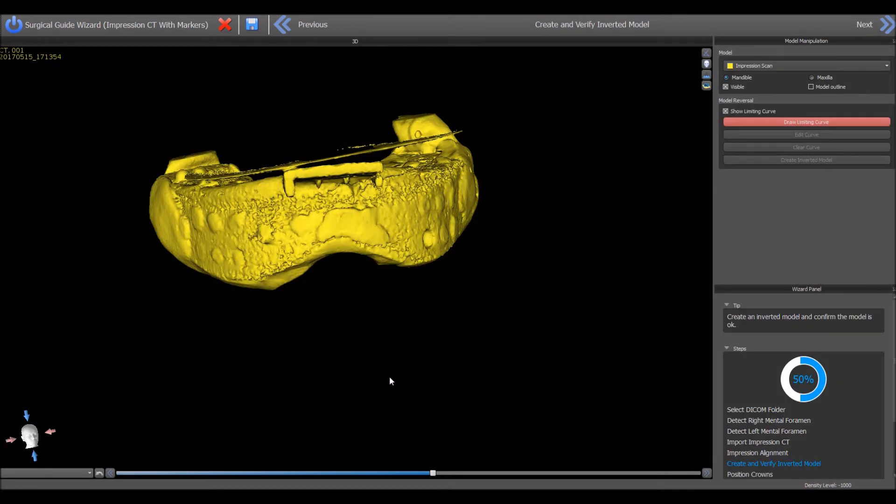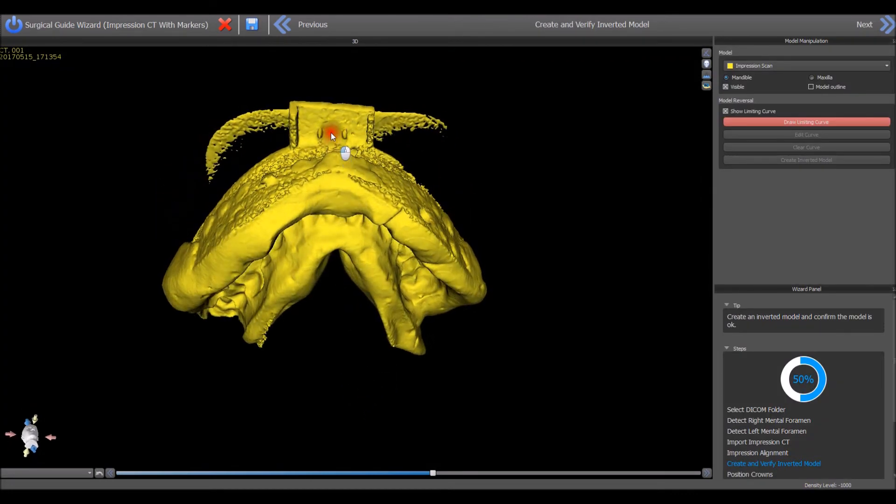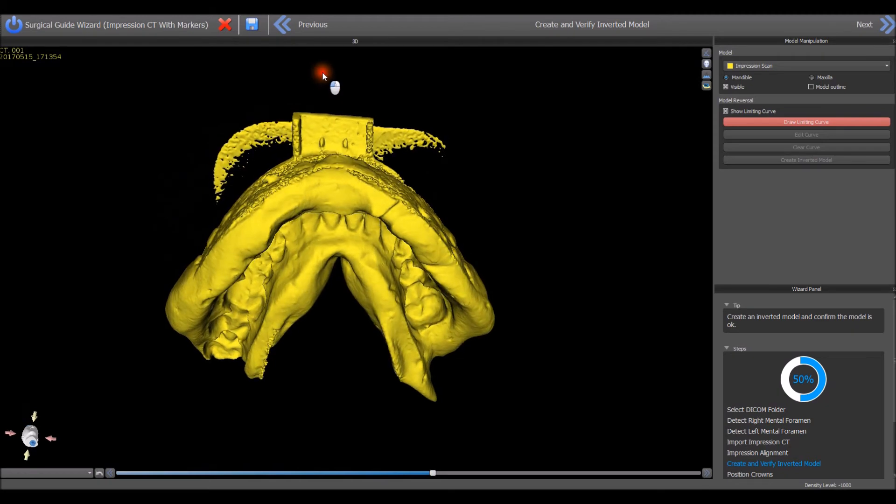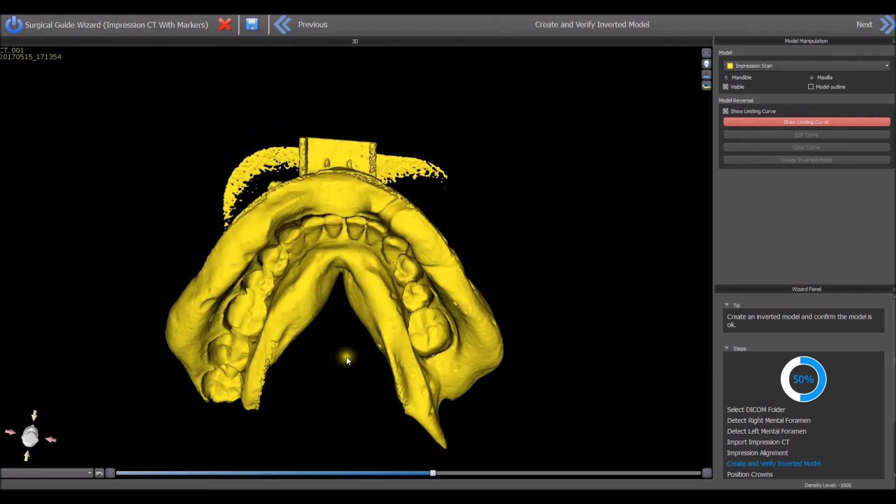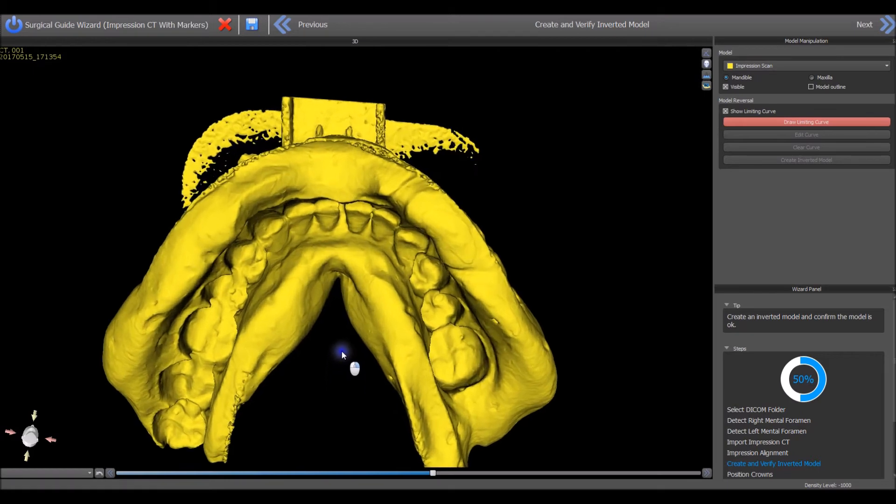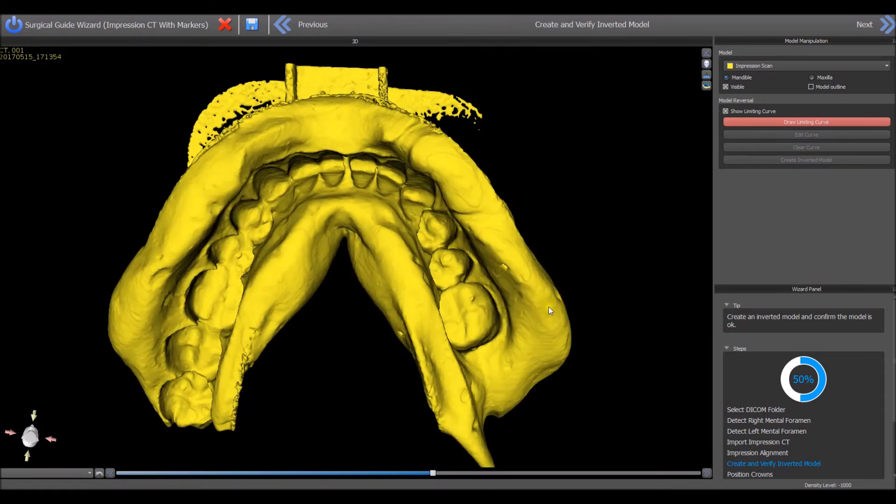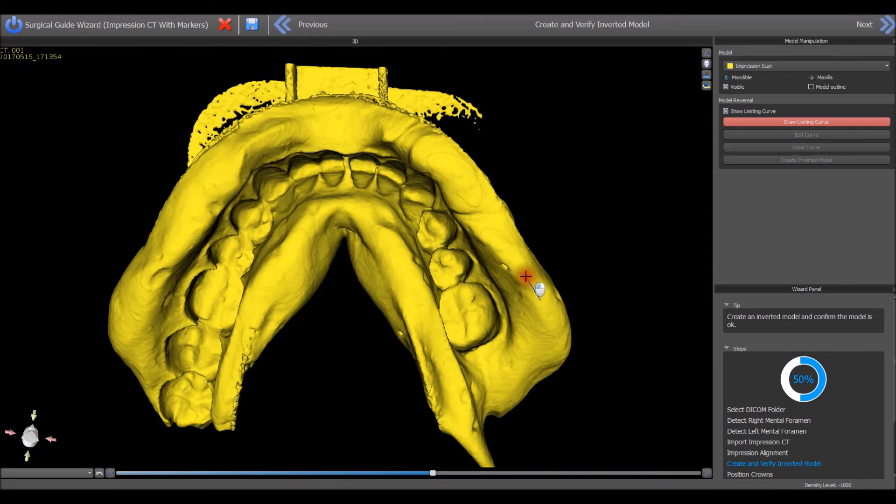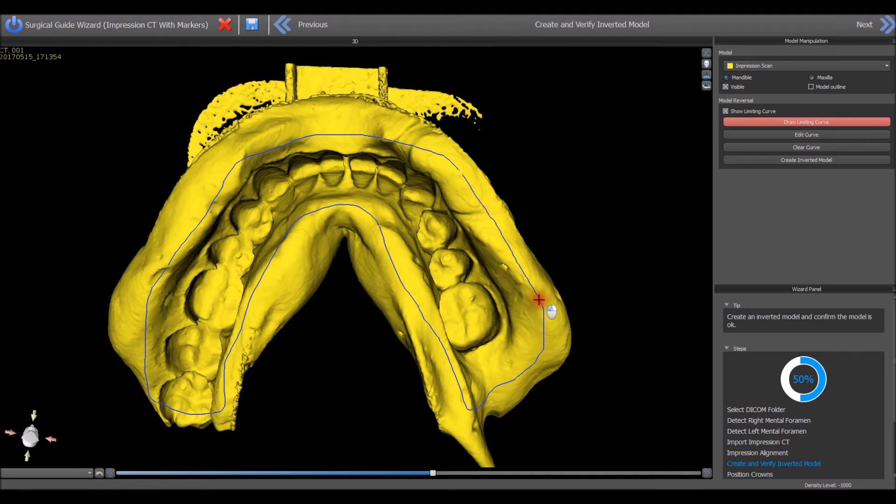Hold the left mouse button to grab and rotate the Impression Scan. Hold the right mouse button and move the mouse forward to zoom in. Hold down the Shift key and the left mouse button to draw a curve to define the area that should be inverted into a model. Continue drawing the curve until the entire relevant area has been indicated and return to the start point to close the curve.